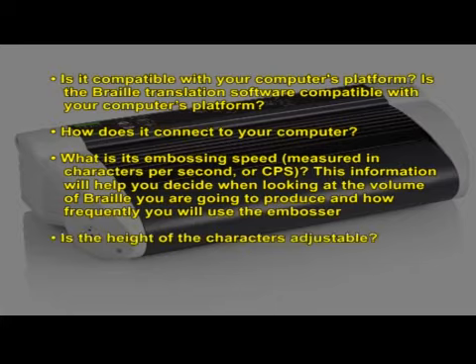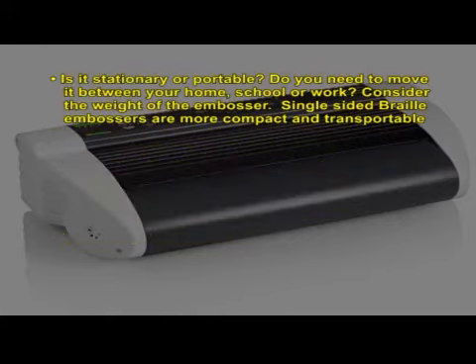Is the height of characters adjustable? Is it stationary or portable? Do you need to move it between your home, school or work? Consider the weight of the embosser.